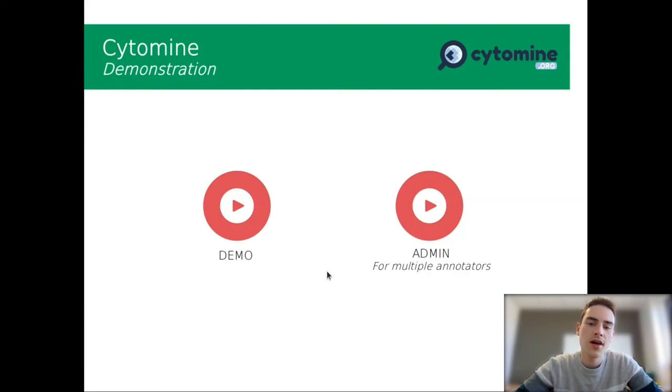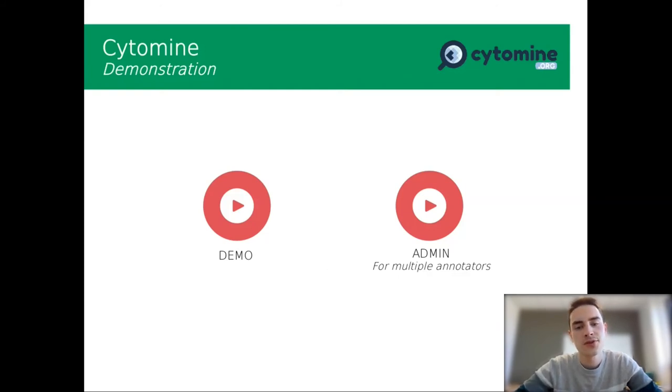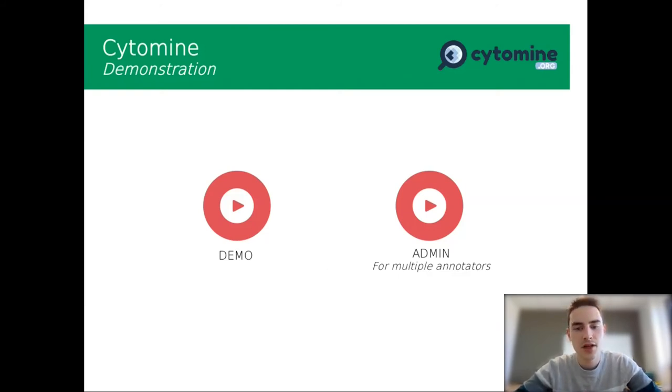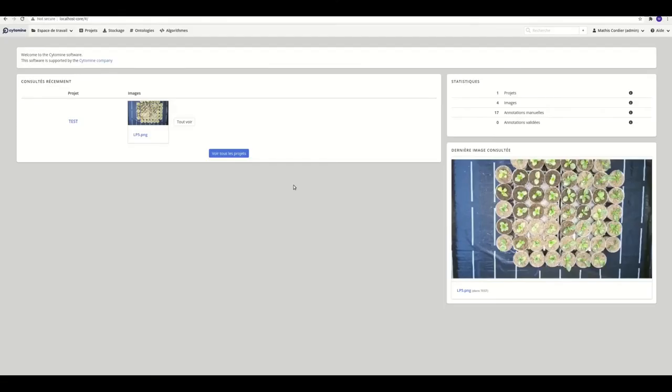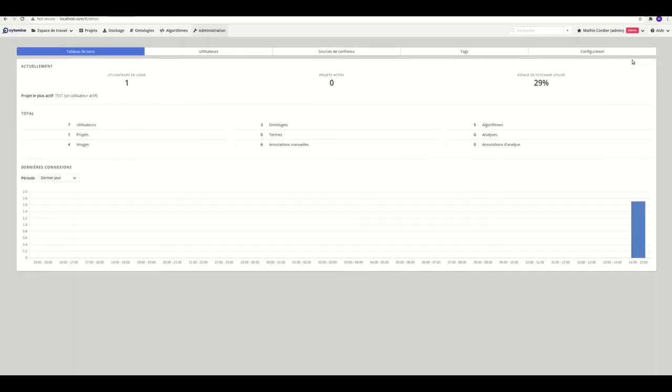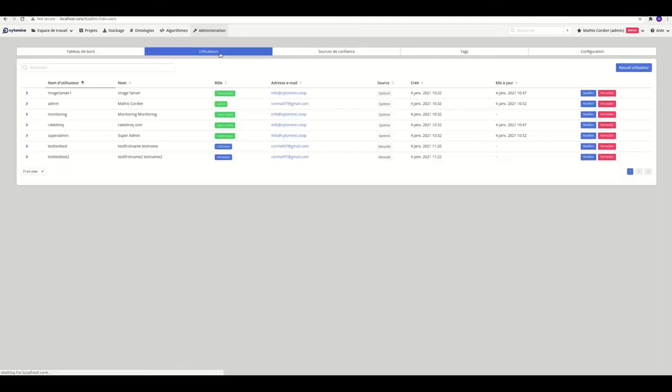Now I can show you a small demonstration of the admin part of Cytomine if you want to deploy it as a server. So let's go for just a little demonstration of the admin session of Cytomine because we installed it as a server.